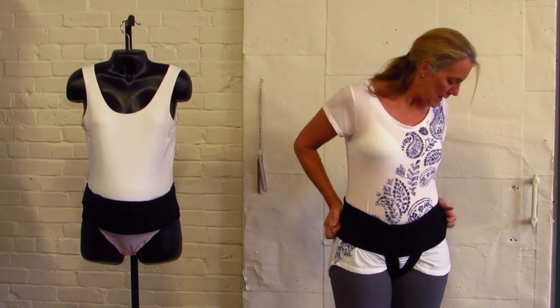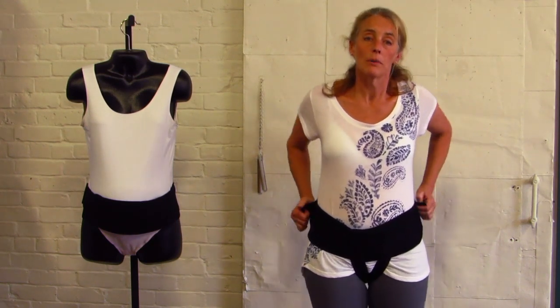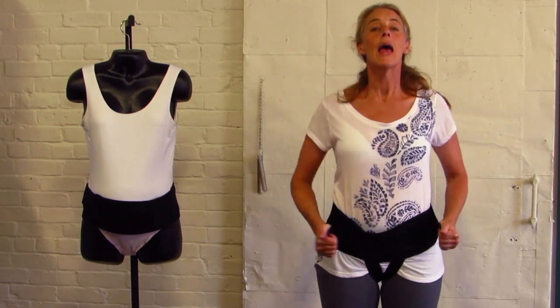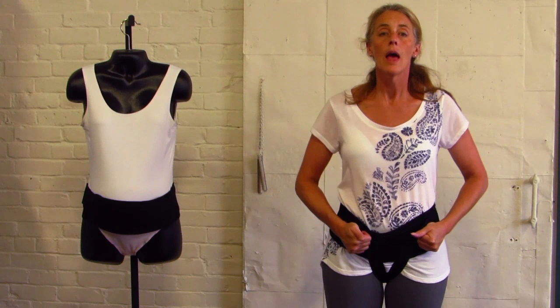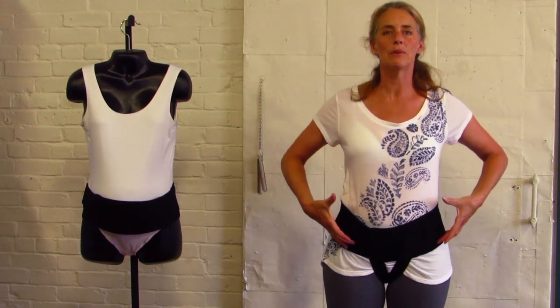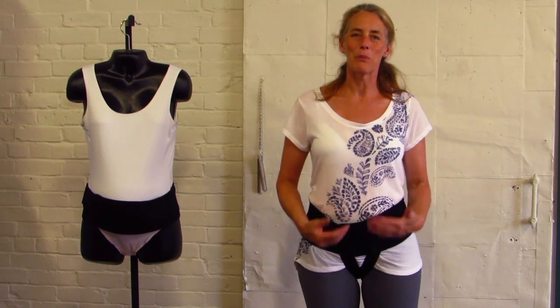If you need extra abdominal lift, take your extra support band and give it a good pull forward, then release it onto the abdominal band. That really lifts the abdomen and takes the pressure off the pelvic floor.